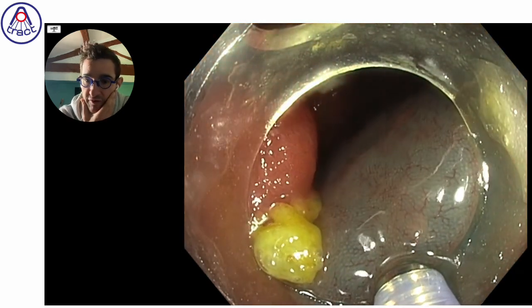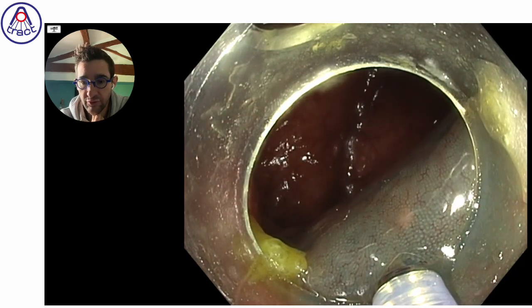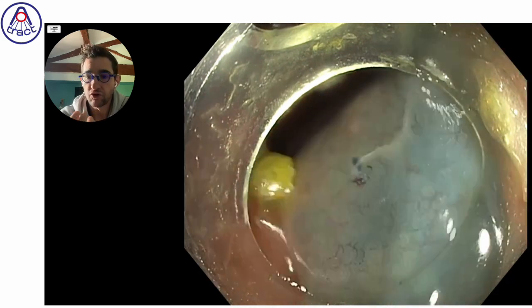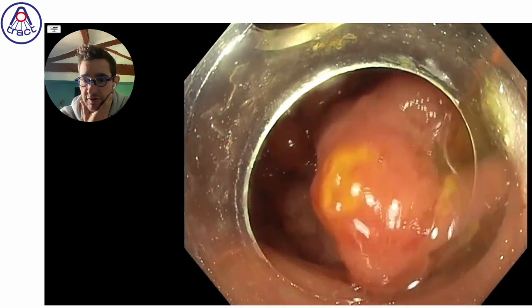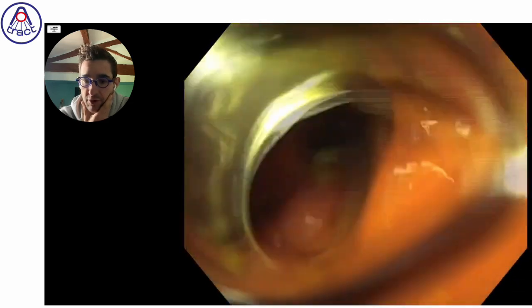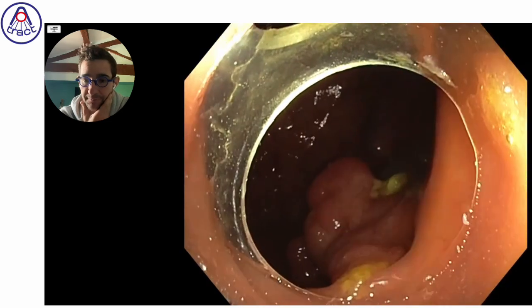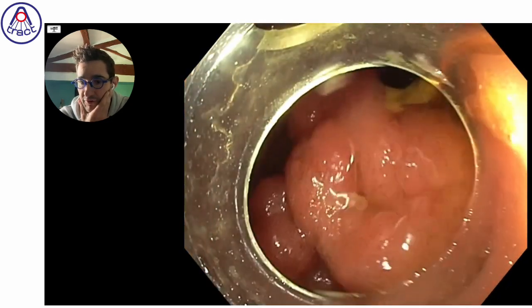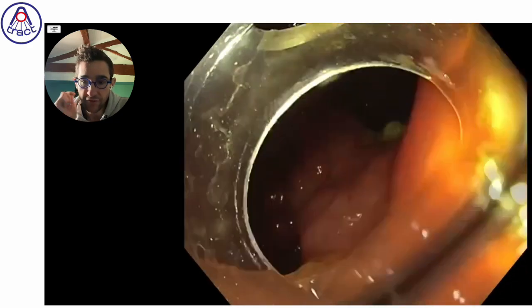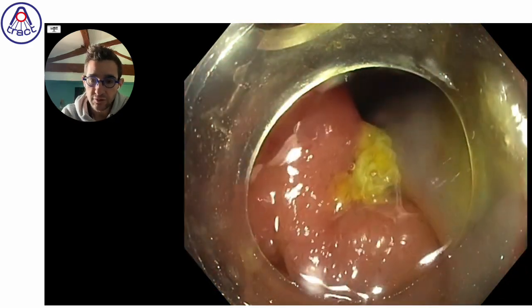The colonoscopy was described to be quite difficult by the gastroenterologist who sent the lesion. That's why we did not choose the short therapeutic pediatric colonoscope, but a longer, stiffer one, to be able to reach the caecum quite easily with a relatively good maneuverability. So the lip of the valvula is just on the right, and the lesion is going down into the caecum.